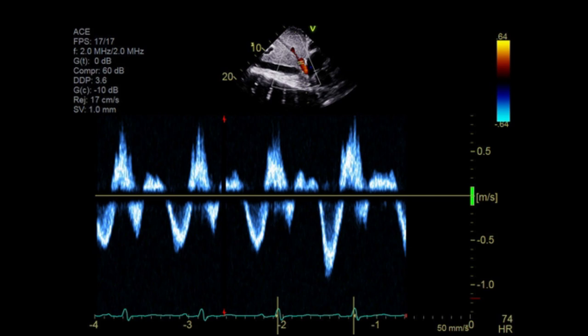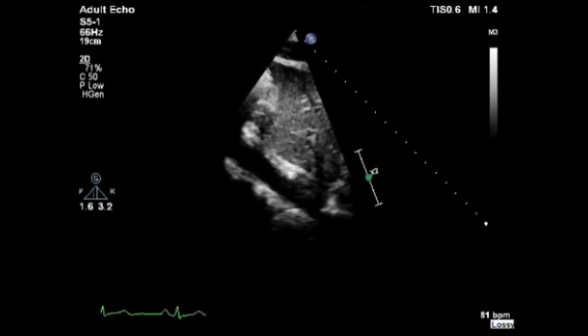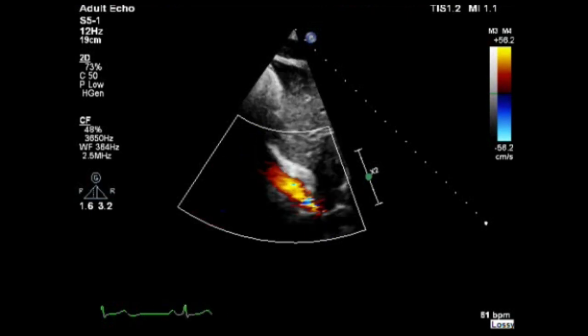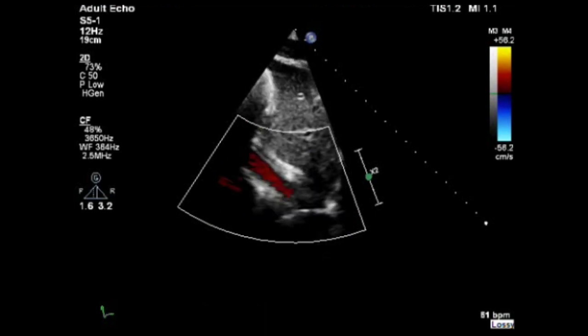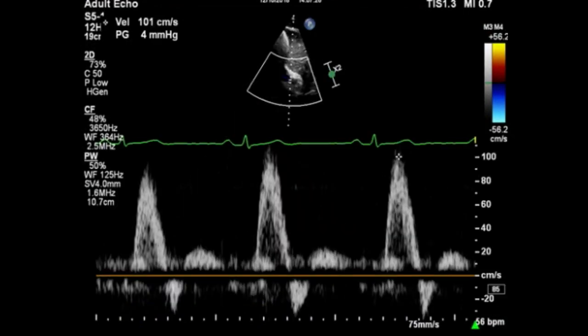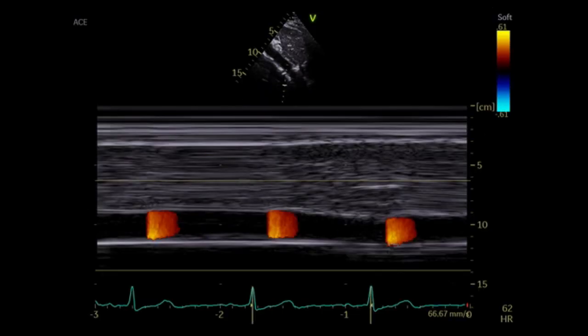Next to the inferior vena cava we have the hepatic veins. Use color Doppler and pulse wave Doppler to assess the hepatic veins flow. Now find the abdominal aorta, visually assess it, and measure its size. Then use color Doppler to assess the abdominal aorta forward flow and check for any reversal flows. Place the cursor on top and use pulse wave Doppler to obtain the abdominal aorta velocities and check for any reversal flows. If you have any doubts about the abdominal aorta size, measure the diameter by 2D.